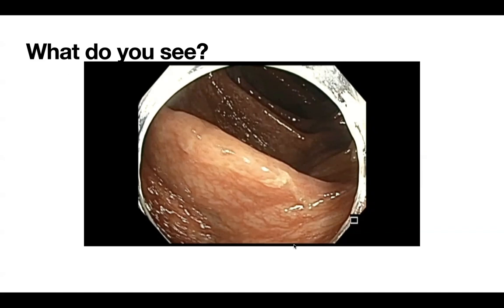May I ask a question, Professor Raju? Please. I was wondering whether you can give us some more detail about the sedation of the patient and the type of endoscope you have used, the type of colonoscope you have used in this procedure. Right. So in this one, once I read the report and that she had a difficult exam, I picked up a PD colonoscope for her.